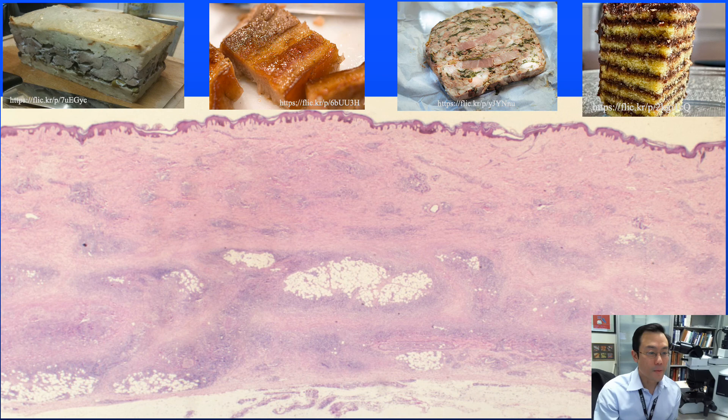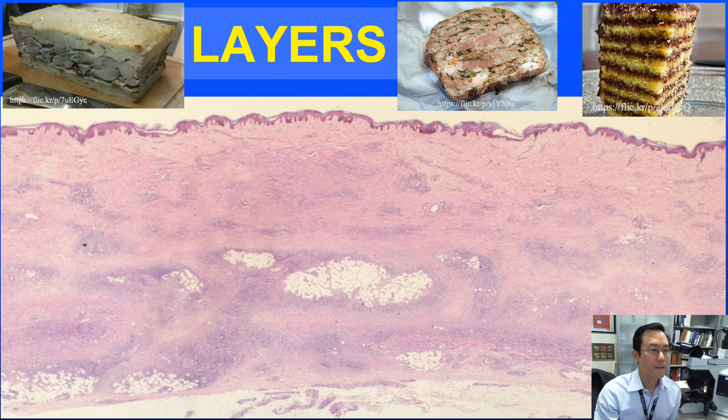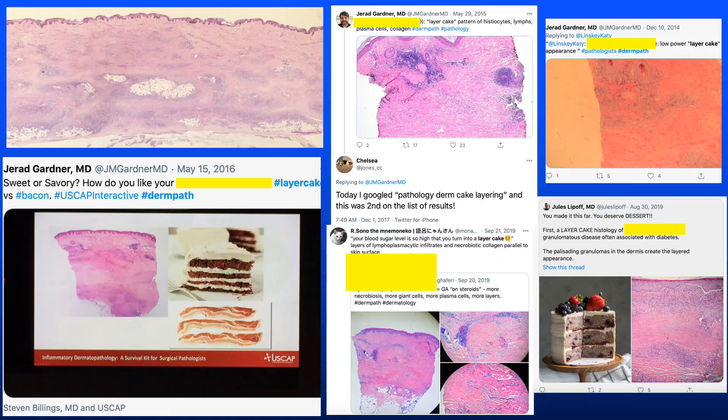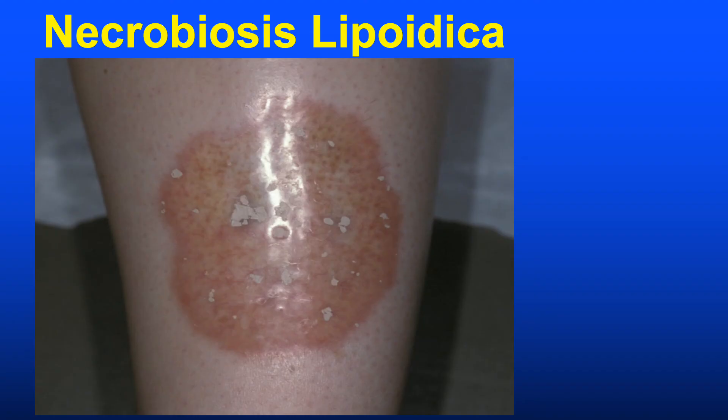Next case: in the DermPath world this is one of the classic food analogies. The concept is to see the layers — like a layer cake. Necrobiosis lipoidica, formerly known as Necrobiosis lipoidica diabeticorum (NLD), is often compared to granuloma annulare, with which it often shares a differential diagnosis.